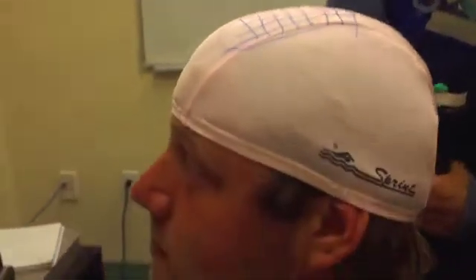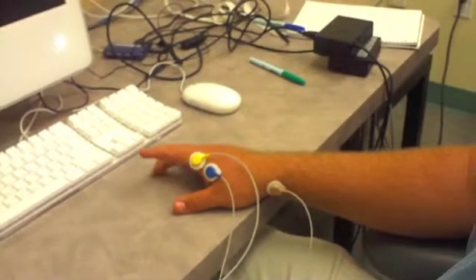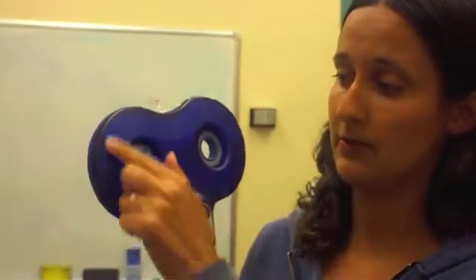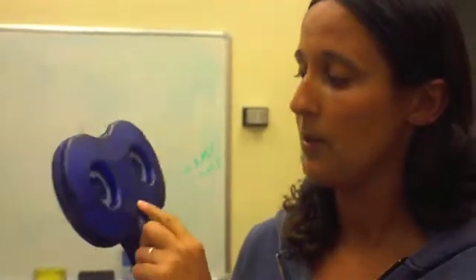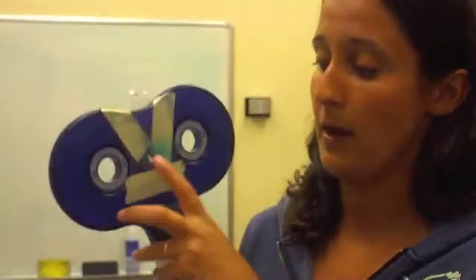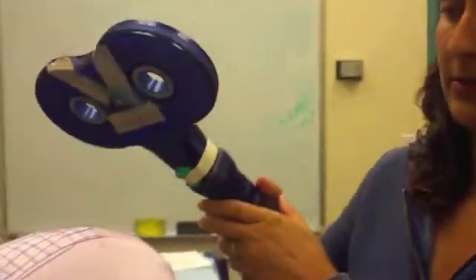And what we're going to do is place this coil over the part of his brain which controls his motor cortex for his right index finger. So the part of his brain that controls his right index finger movement. And what we're going to do is place this coil, which, as you recall, generates an electric field when you press this button. Electric current will go through these wires, which will generate a magnetic field right in this spot. And that magnetic field will then generate an electric field in his brain.